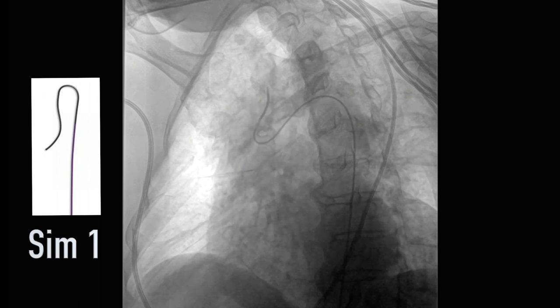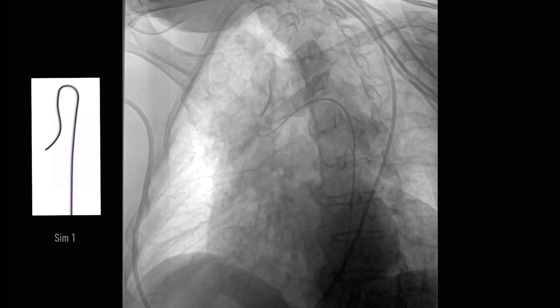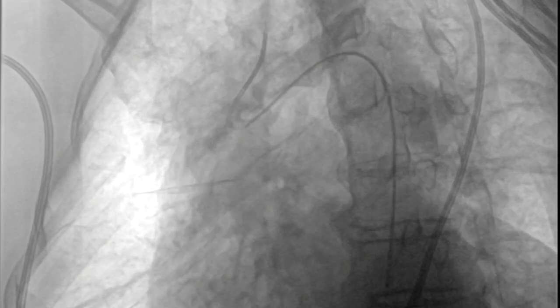Once the catheter is reformed, the wire is pulled out of the innominate back into the catheter, and then we engage the catheter by pulling it back and rotating it up into the origin.